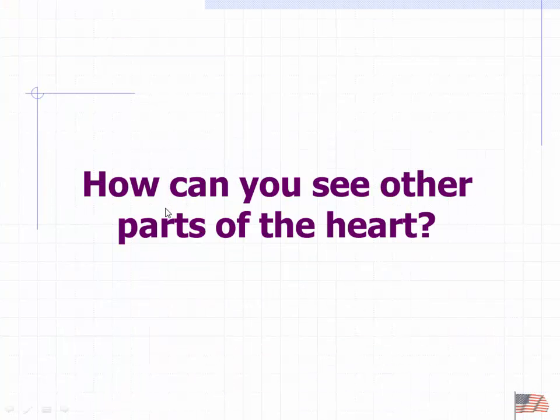Primarily what we were talking about is identifying the walls that we talked about. The anterior, the lateral, the septal, the inferior. Posterior is one that's there also, but we don't normally look at it.